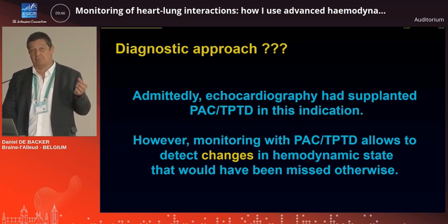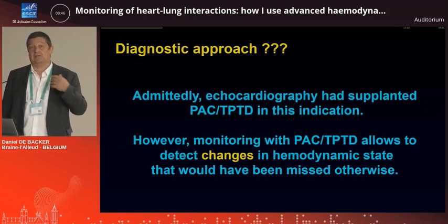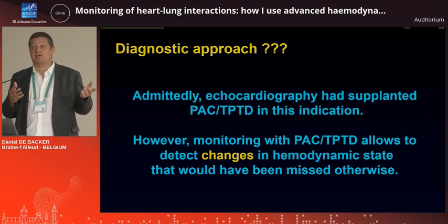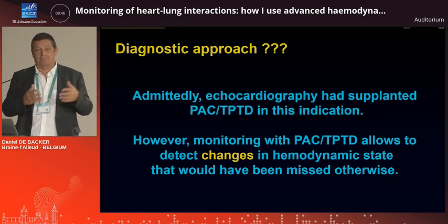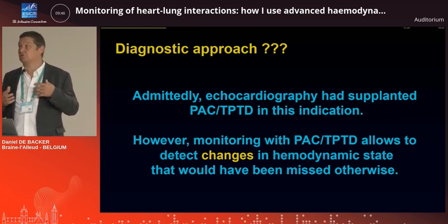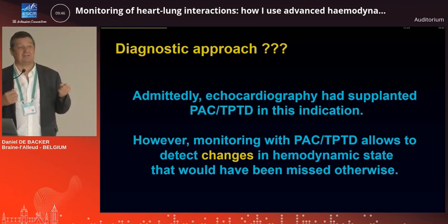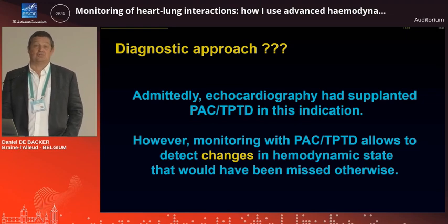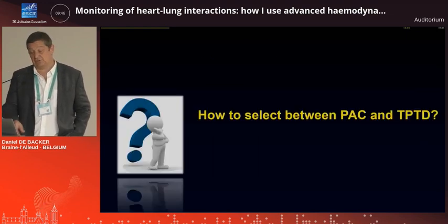And we often discuss this with Antoine Vieillard-Baron. I mean, you do how many echoes per day? Well, if you do one echo per day, it's already quite a lot in many of your patients. So at the end, that's a limitation, and in between, the patient may change, and that's why it's good to have some other devices that can be useful.